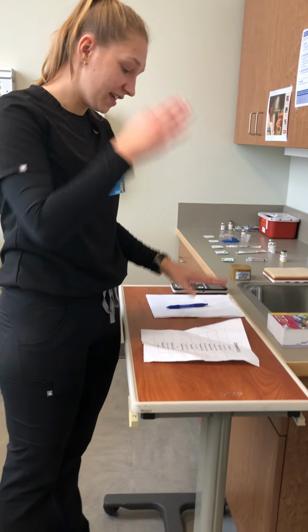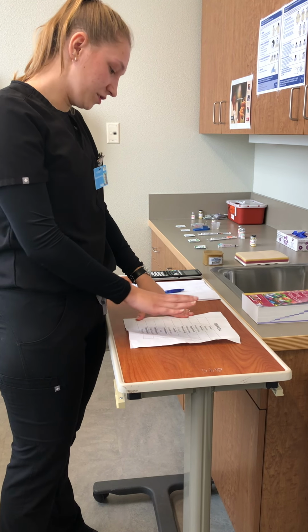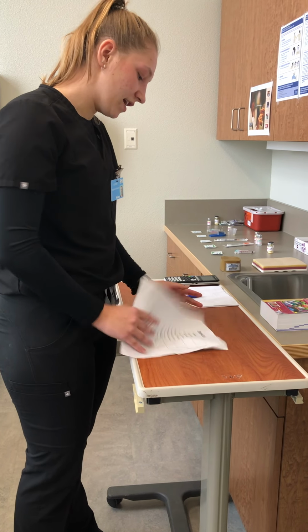Okay, so I'm currently at my Omnicell in the medication administration room. I'm going to be looking between my Omnicell and my MAR chart, and this is going to be my first check for the medications. So I'm going to go ahead and see what I'm ordered.